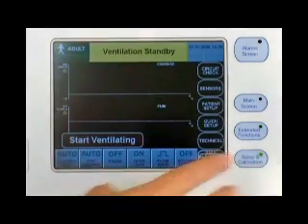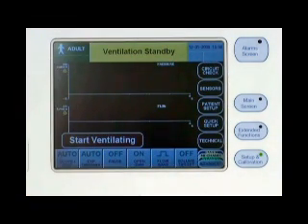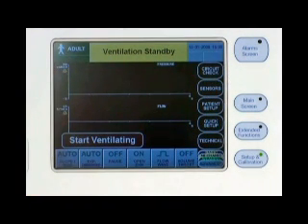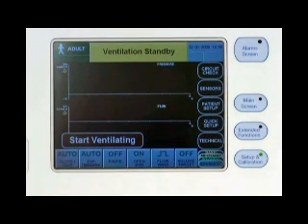The setup and calibration menu button allows you to access the circuit check, which can be done only while in standby condition, access the sensor calibrations which can be done at any time during standby or ventilation, and access the patient setup and technical setup parameters. The saved screens and event history logs are downloaded from the technical setup screen.